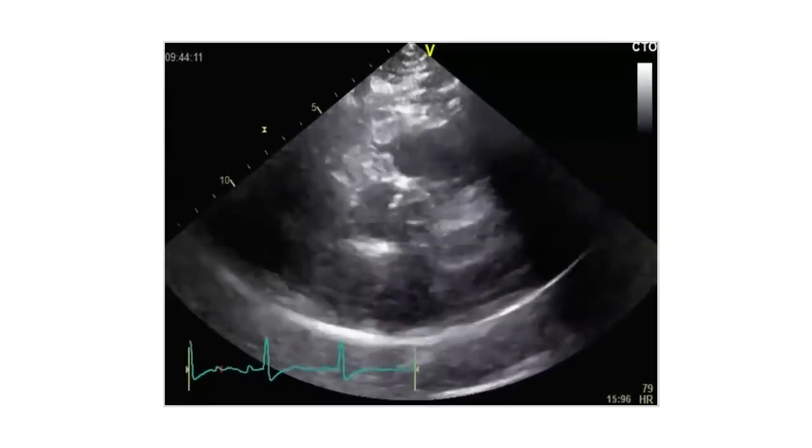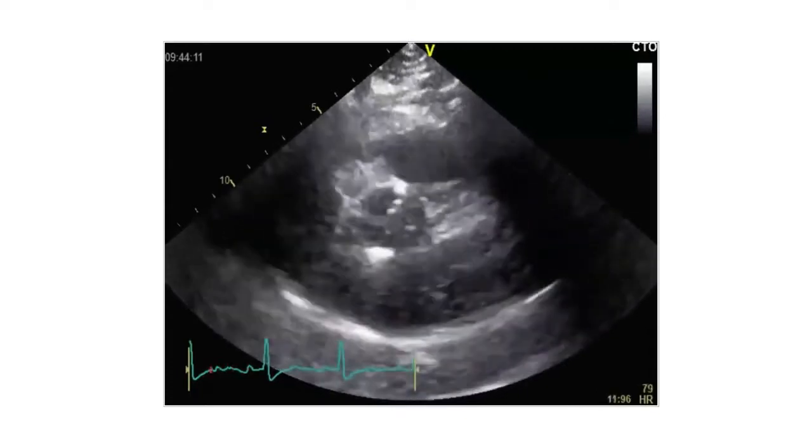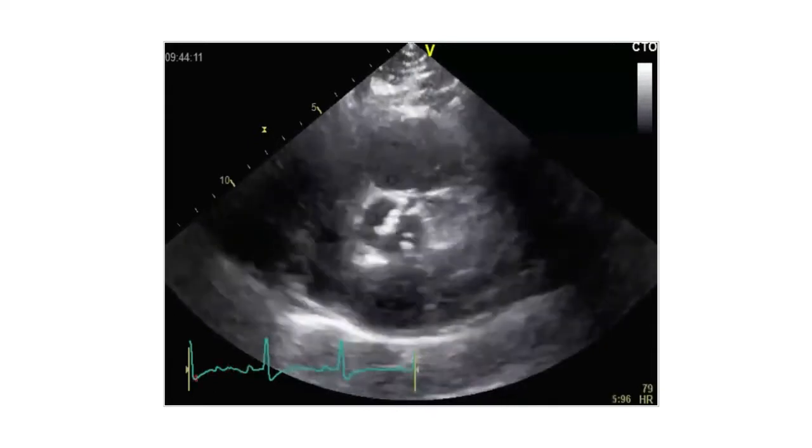However, beware, sometimes you can be fooled. As I already mentioned, especially in young individuals, even tender aortic valves can be stenotic. Now, one more example of a severe aortic stenosis. In this case, it was a relatively young individual, but you can see that part of the aortic valve is very strongly calcified.